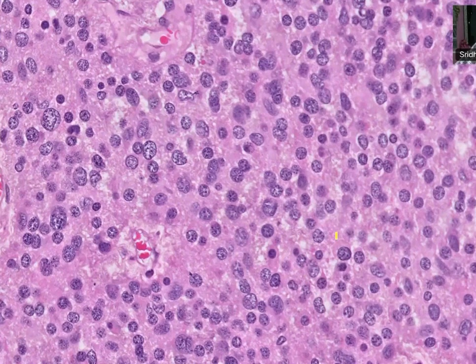So, sir, whenever you get a picture like this, it's very difficult to say directly that it's an astrocyte. It can still be an oligodendroglioma. The biggest feature for oligodendroglial tumors is monomorphicity. You may get hallowness or you may not get a halo, but you are not seeing a halo here. The difference is, it's a more or less monomorphic, mitotically active cellular tumor.